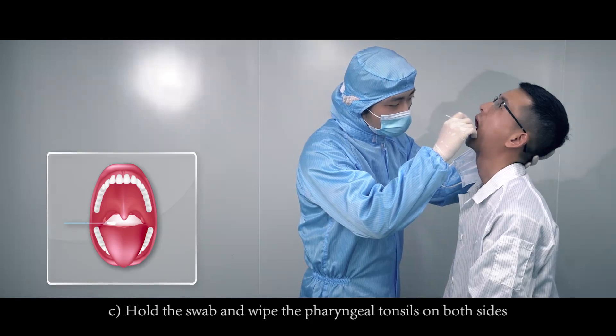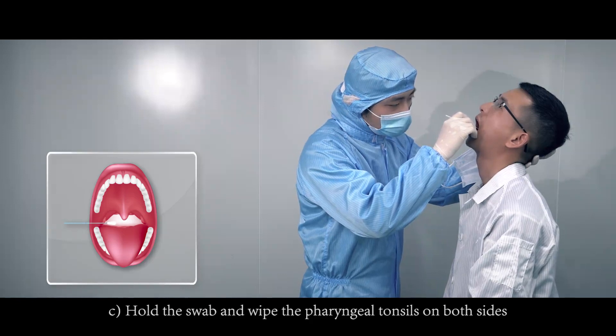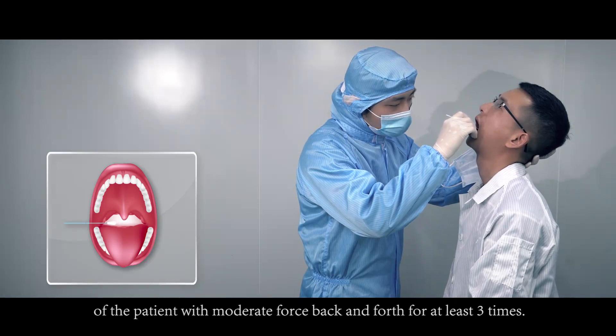Hold the swab and wipe the pharyngeal tonsils on both sides of the patient with moderate force back and forth for at least 3 times.